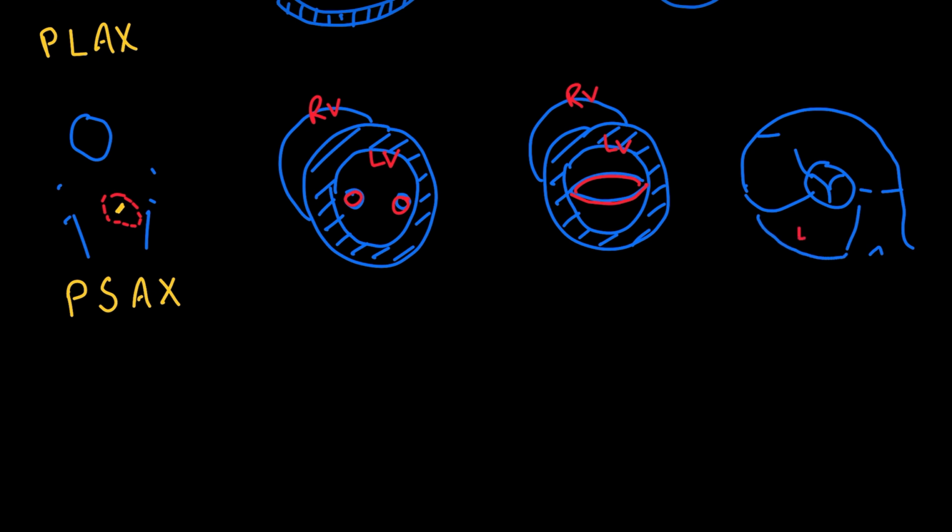This is your left atrium. You've got your intraatrial septum. This is your right atrium, tricuspid valve leaflets, the right ventricle, your pulmonic valve, and then your pulmonic artery, which branches into the left and right pulmonary arteries. And in the middle, you have your aortic valve right here, this Mercedes-Benz.